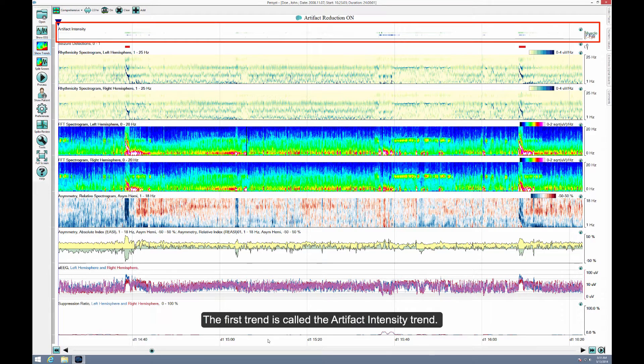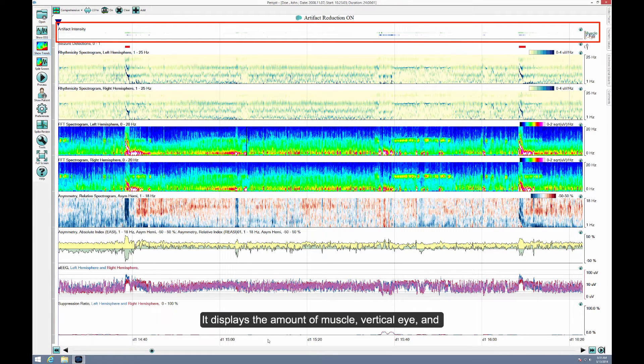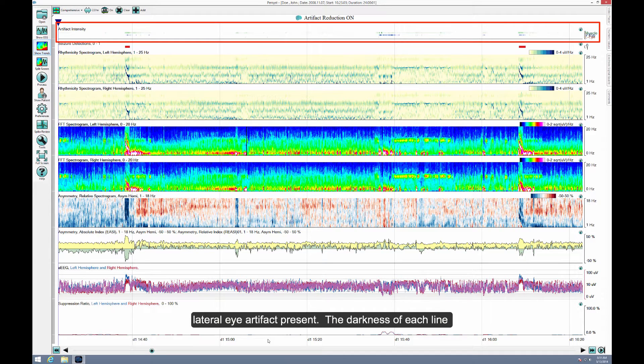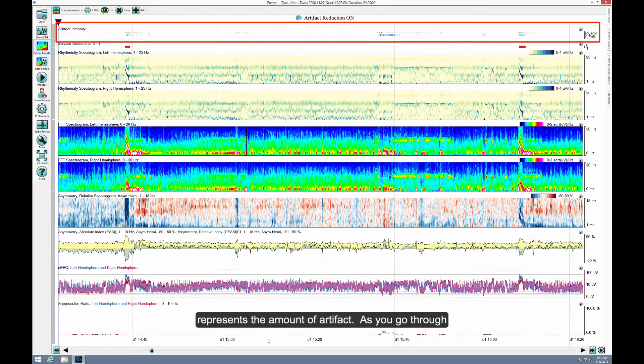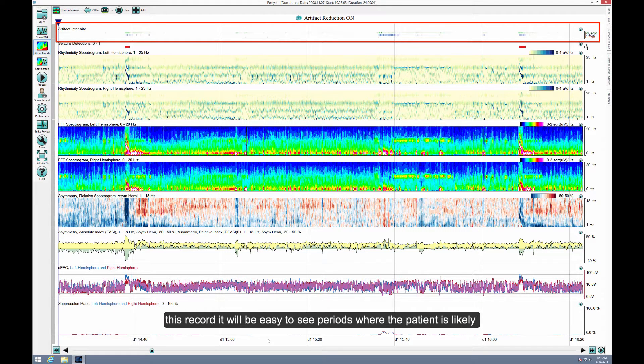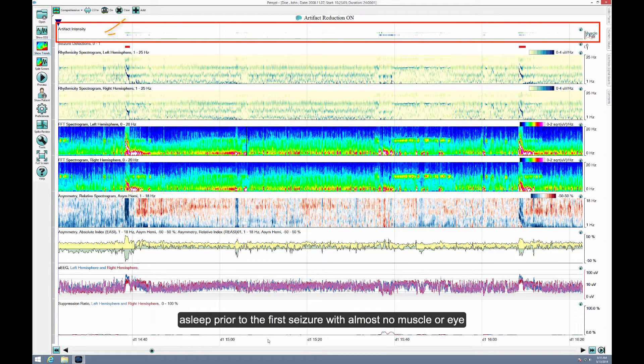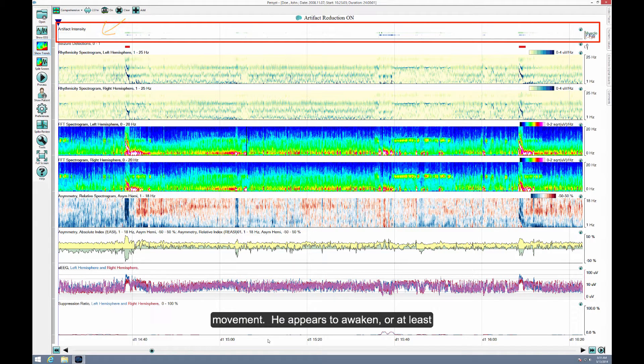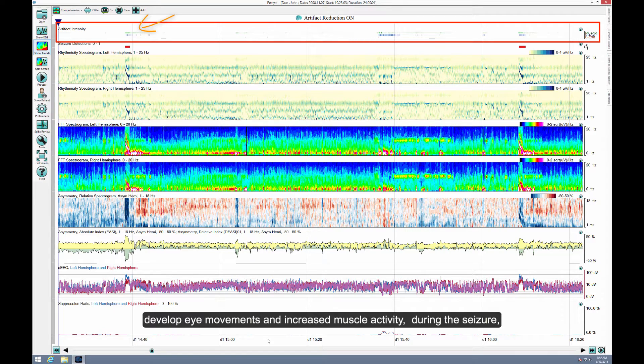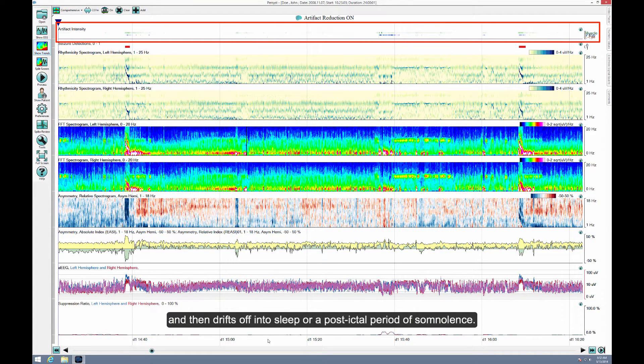The first trend is called the Artifact Intensity Trend. It displays the amount of muscle, vertical eye, and lateral eye artifact present. The darkness of each line represents the amount of artifact. As you go through this record, it will be easy to see periods where the patient is likely awake or sleeping. For example, the patient is probably asleep prior to the first seizure, with almost no muscle or eye movement. He appears to awaken, or at least develop eye movements and increased muscle activity, during the seizure, and then drifts off into sleep or a post-ictal period of somnolence.